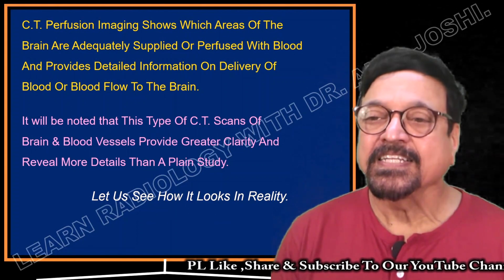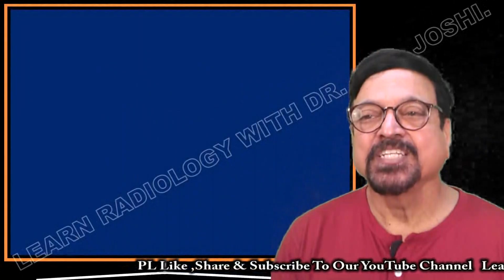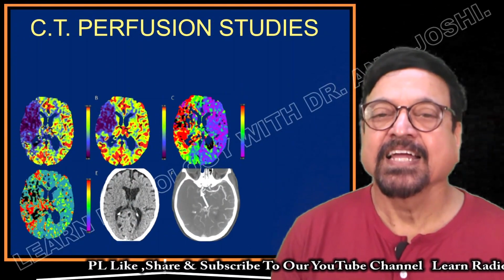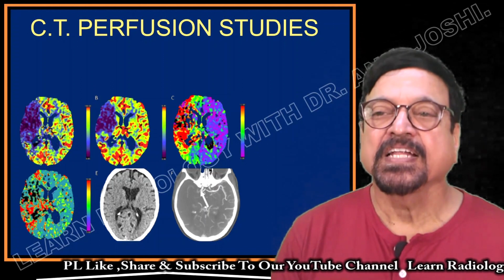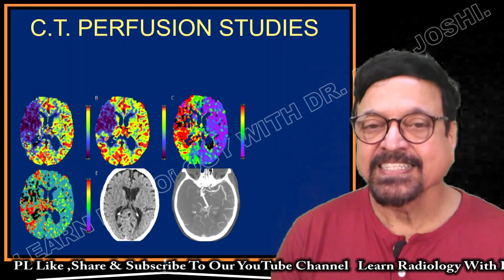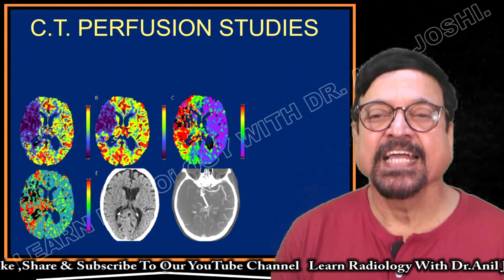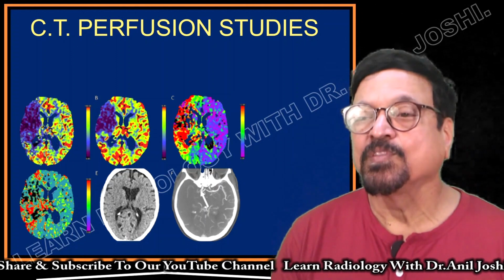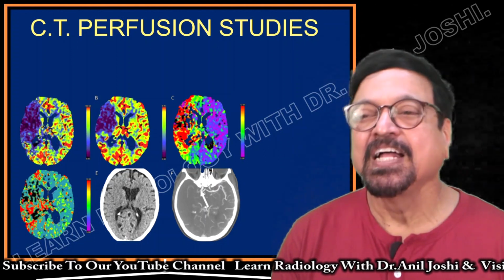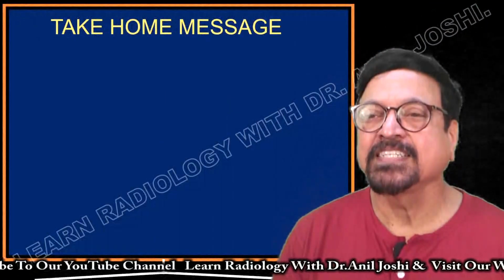So let us see how these perfusion scans look in reality. They are color coded, but you can clearly see which are the areas at risk, which are the areas which are infarcted, and which are the areas which are ischemic. We are more concerned with the ischemic tissues which we want to save, and this is shown on the angiography also. You can see a block at the vessel.